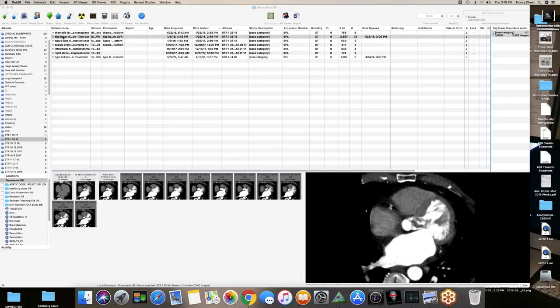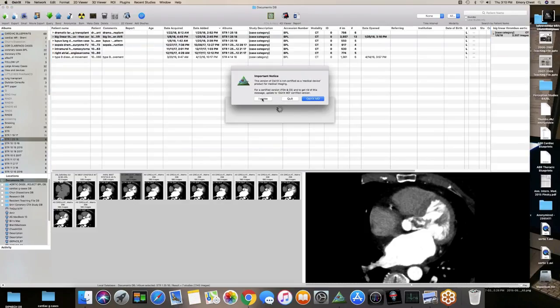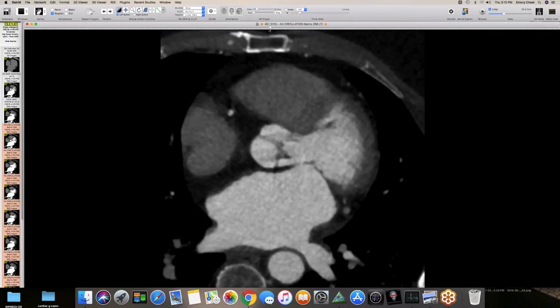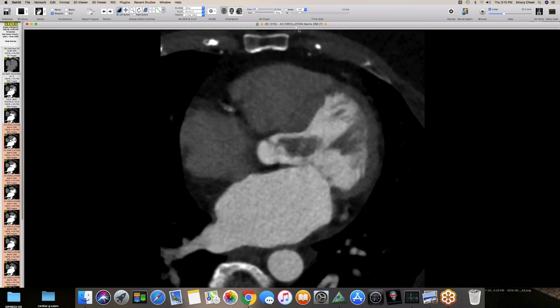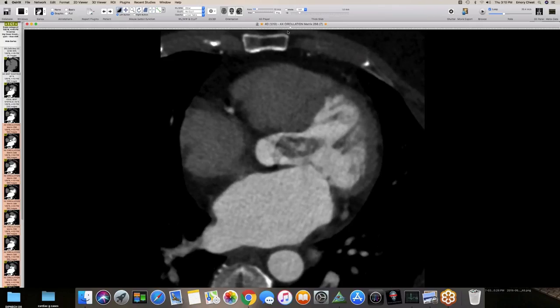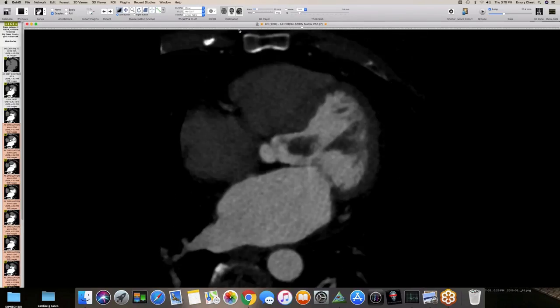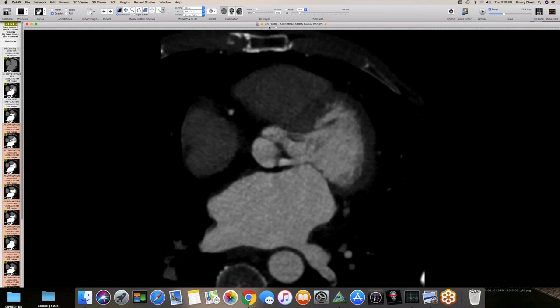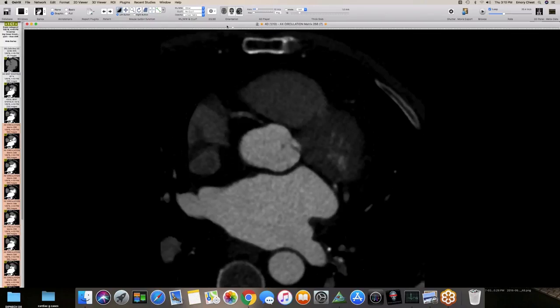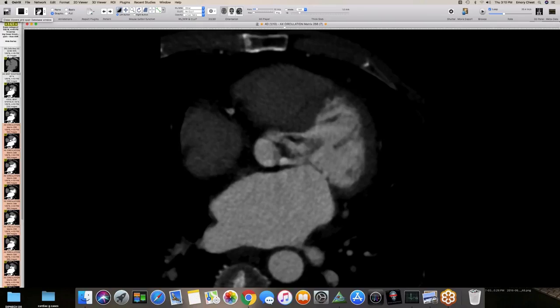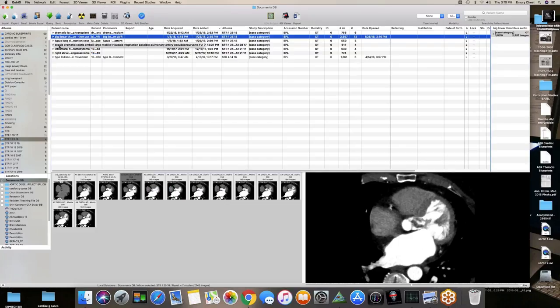Looking at that nidus — at about six o'clock position on the valve, there was probably a speck there. You wonder if that was the lead point, a nidus for the thrombus formation. Very strange.